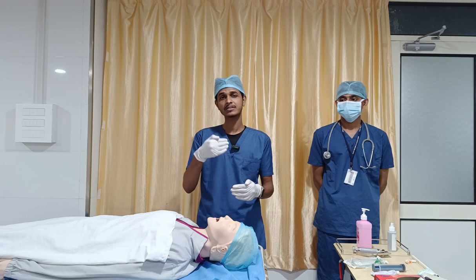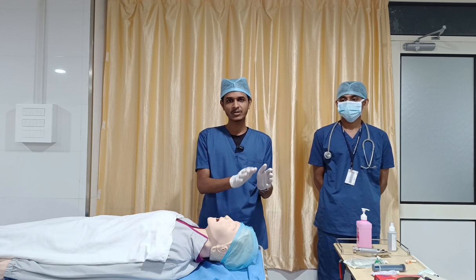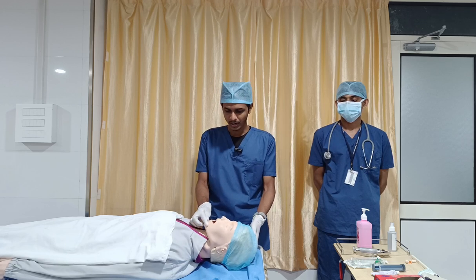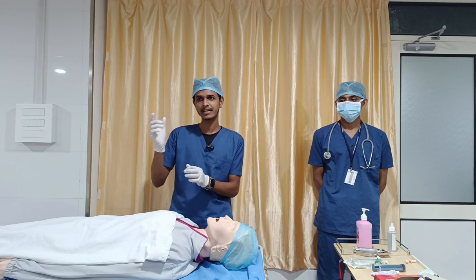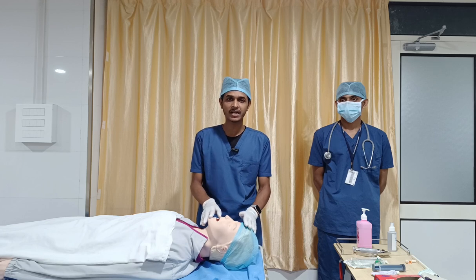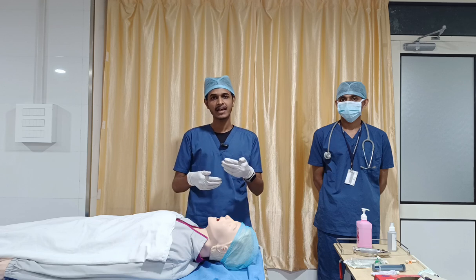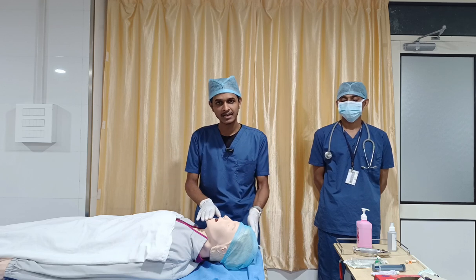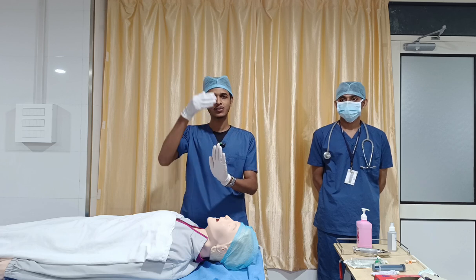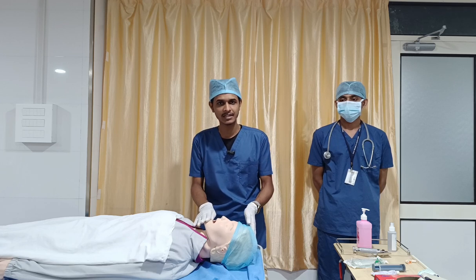And then, not alone the conscious oriented, but for both persons you have to slightly flex the neck like this. Why are we flexing? Remember, correlate with your airway manipulation. There we do the head tilt chin lift manner. By that we are angulating your airway axis in a straight line. While giving a neck flexion, it will move your trachea a little forward, thereby you can easily get access to your esophagus. That is why you have to slightly flex the neck like this.